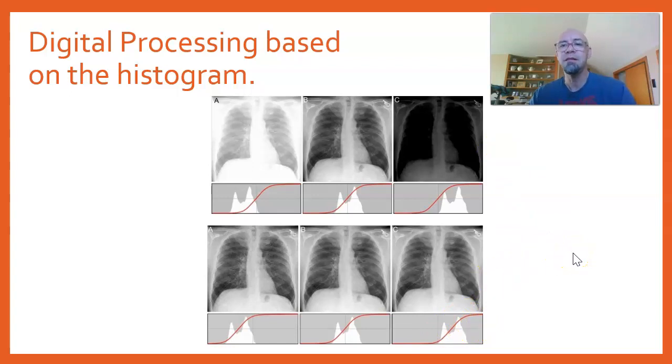And so that's basically what the computer's doing behind the scenes, is looking at all of those measurements of the scintillators or whatever it is, however we're doing it, CR or DR, and we just take those shades of gray and we match it to the perfect histogram. Move it to the perfect shades of gray, and then we get the image that we need.